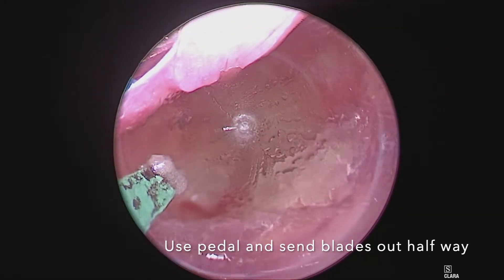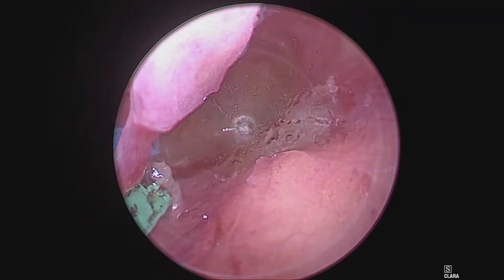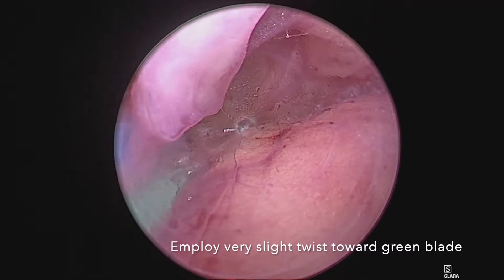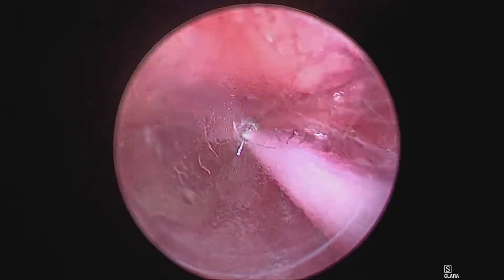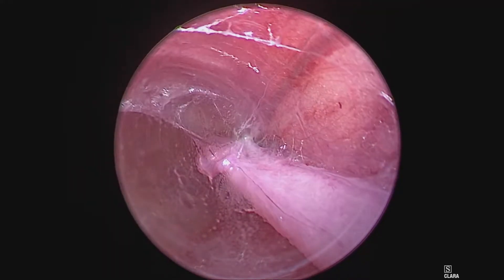Cauterize and slide the blades forward while you're cauterizing, and that will cut and seal the branch. A very simple and effective technique. The branch is sealed and the tunnel stays dry.